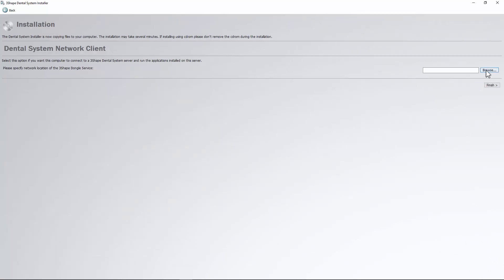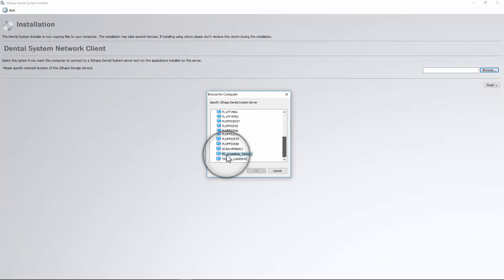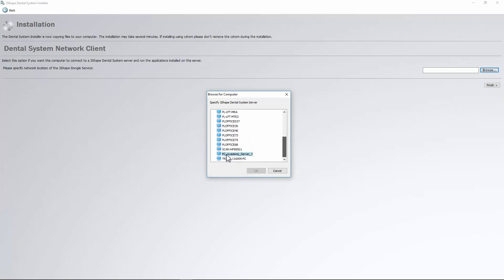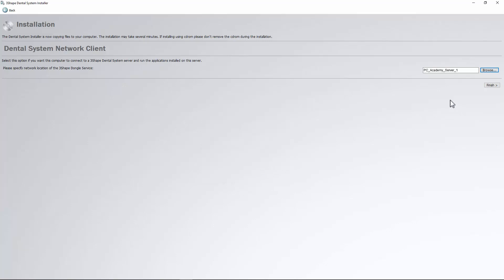In the next window, select your server PC from the list. Click OK and Finish.